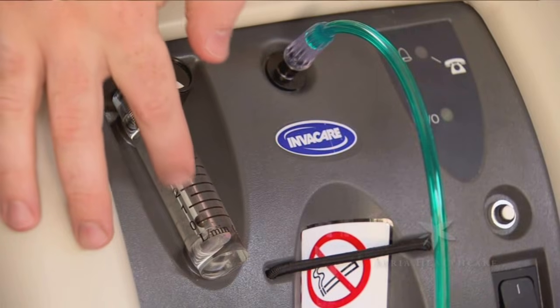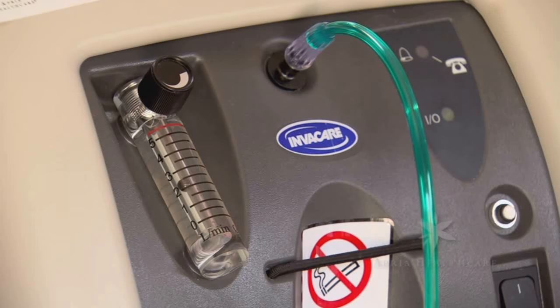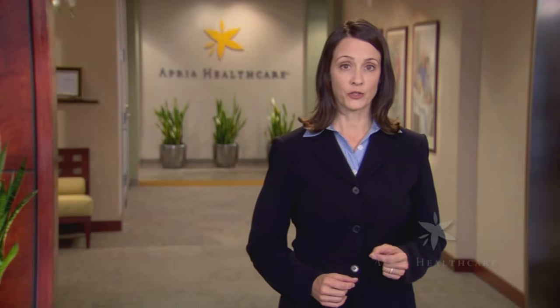All concentrators have a flow control knob or dial with a gauge or tube that shows the flow setting. The center of the indicator ball should be on the line next to the flow prescribed by your doctor. You should not change the flow unless your doctor changes your prescription.